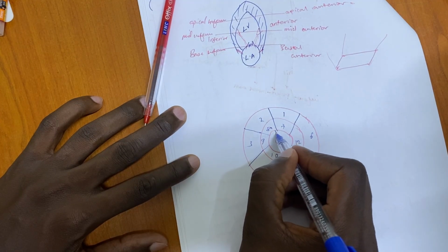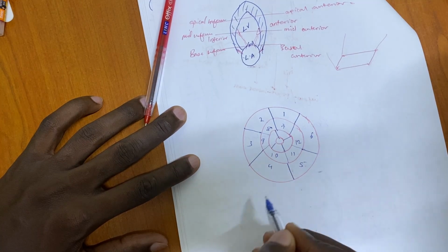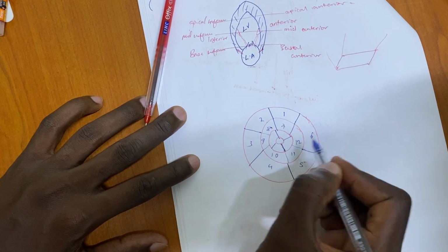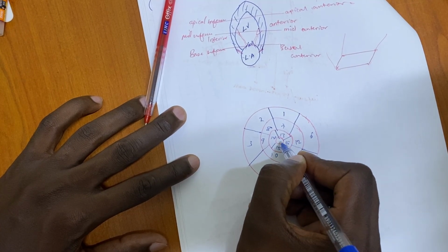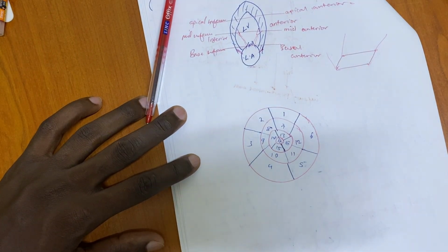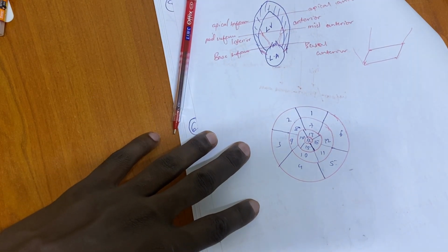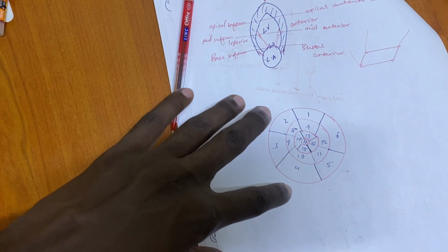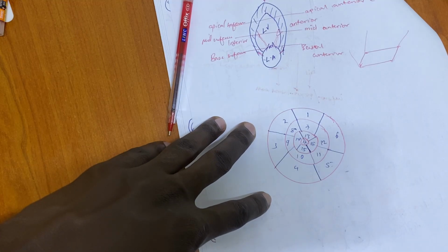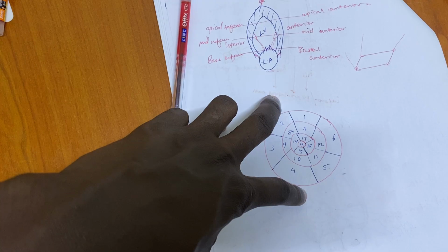As the anterior, 13, 14, 15, 16, and then the apex 17. This is the bull's eye. Bull's eye, when I come to abdominal scan, that is appendicitis. This is the bull's eye. With advanced echo, we shall see how it is used to really assess.